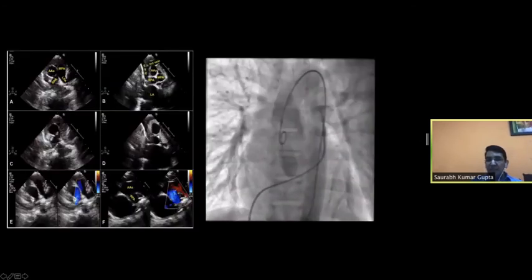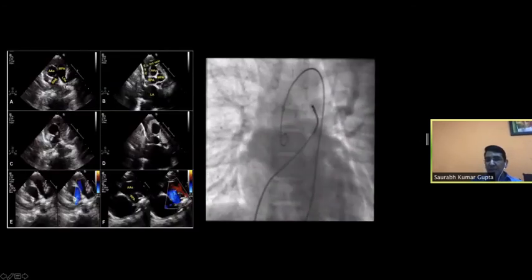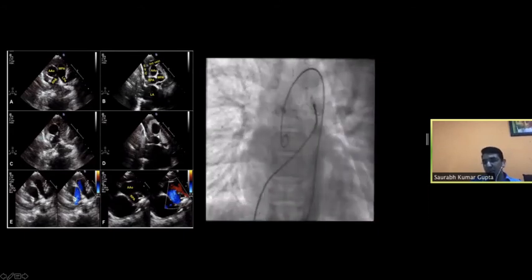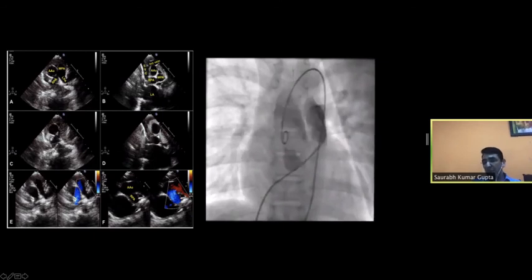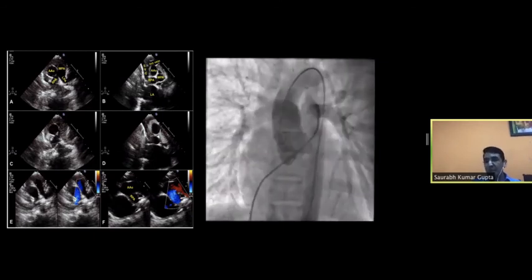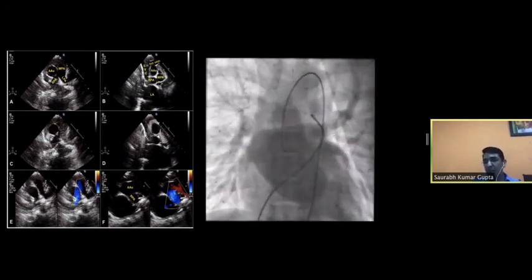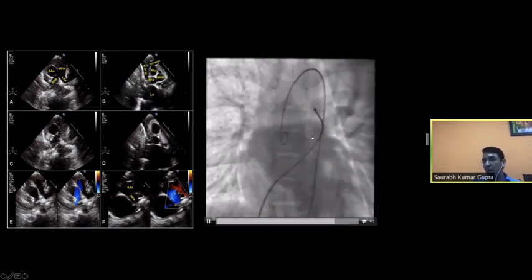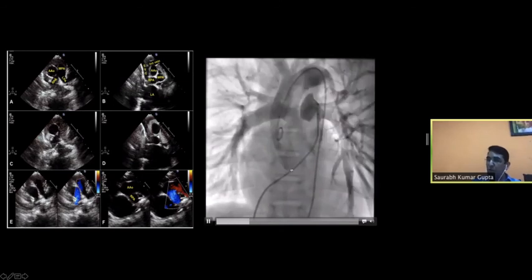And now if you can see over here, these images, the upper two images, were so confusing that they almost made us believe that this patient actually has normal pulmonary artery connection. But in reality, what was happening was RPA was coming out of aorta and LPA was continuing from MPA.